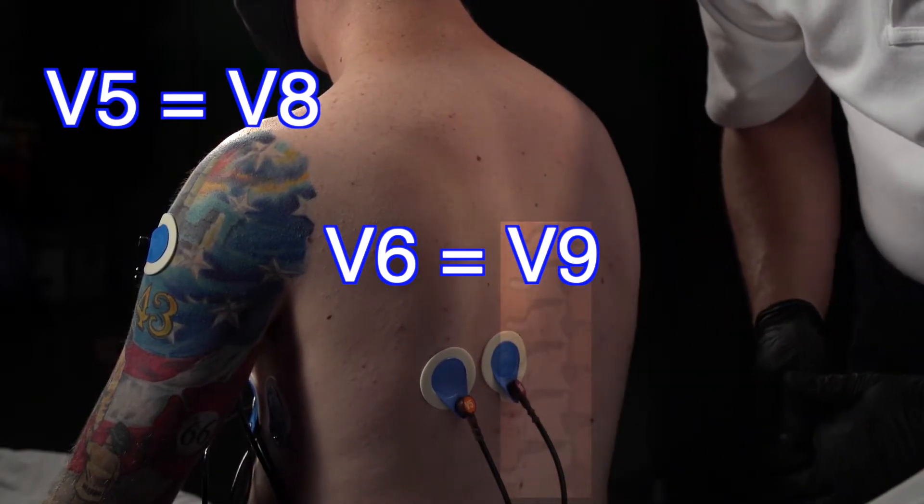Now that we've got this in the correct location, we're going to run another 12-lead EKG. This time it's going to give us those three additional views, completing our 15-lead EKG.